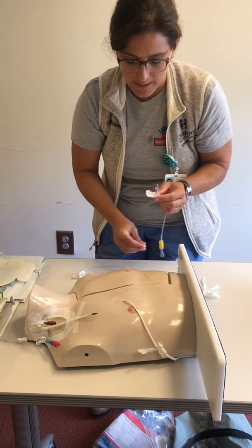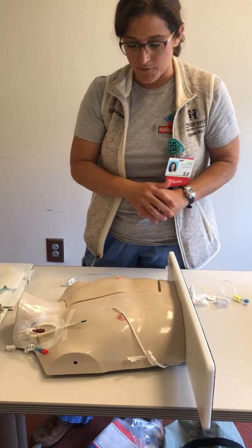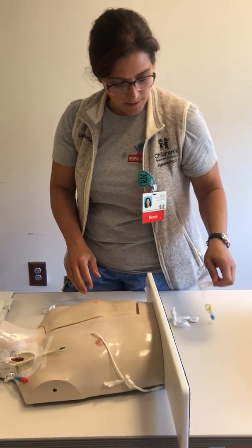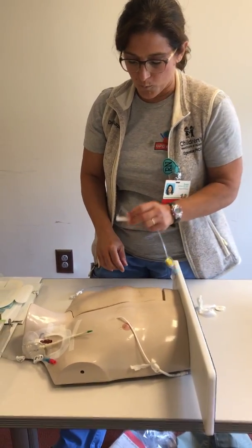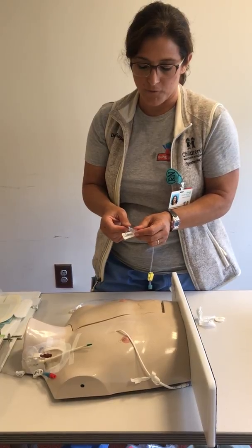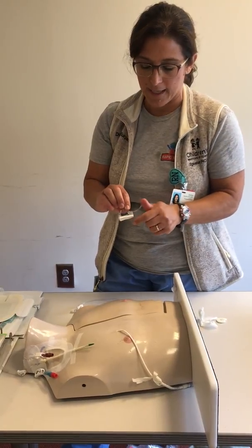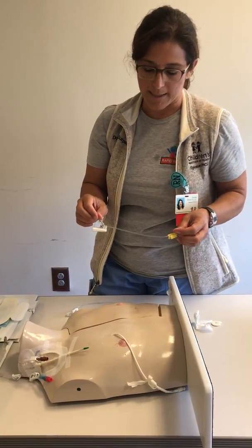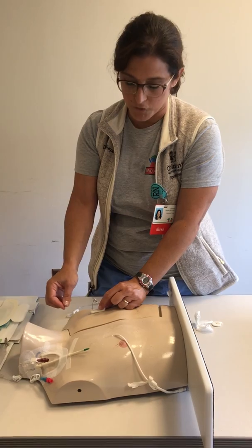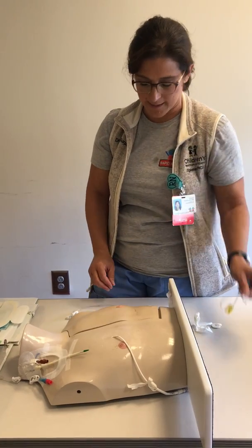After we de-access, some kids may need EMLA, but if they're nice and sedated and you've given them a bolus before you de-access, it's easy to re-access right away. The other thing is you will not de-access if they have epi, norepi, or any kind of vasoactive drips, which means we don't re-access every 7 days. If they have those drips running, you don't have to re-access. You will need to do a dressing change, but be real careful: you'll just be removing the biopatch, cleaning around, and putting the biopatch back and dressing it, but not re-accessing.